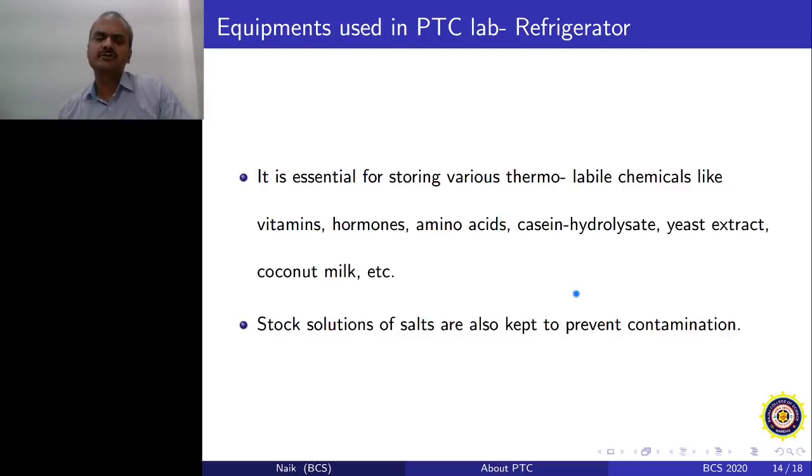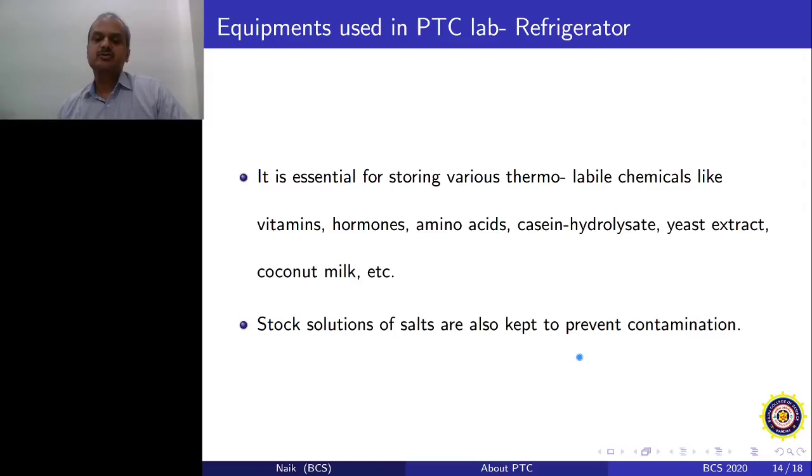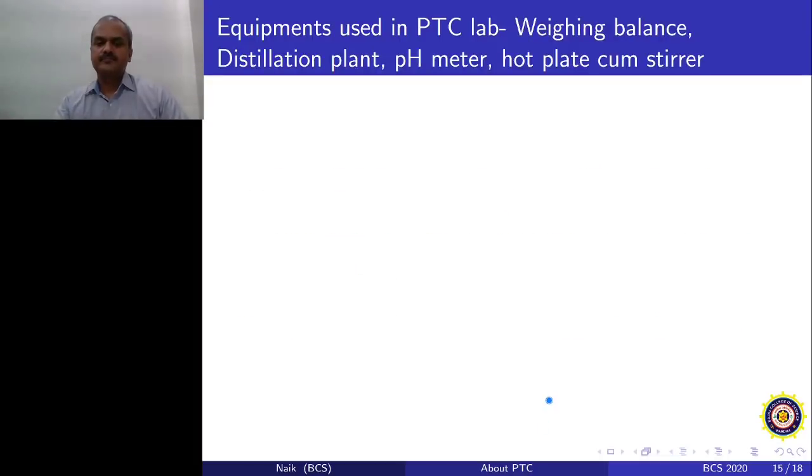If you make some stocks which require a larger storage time, then in that case it is better to freeze them. So that is something important.